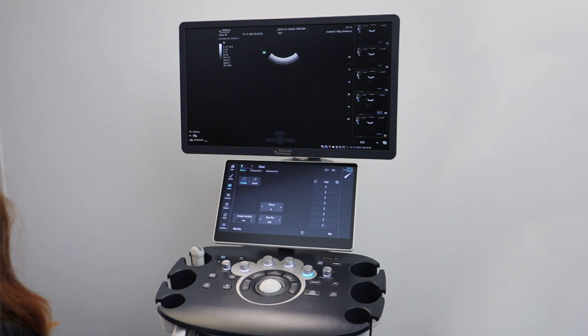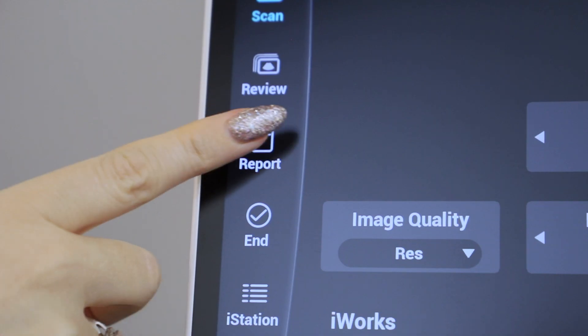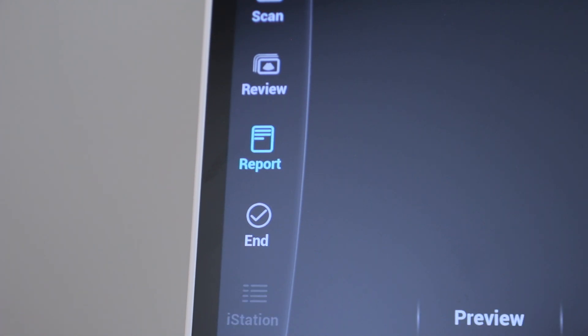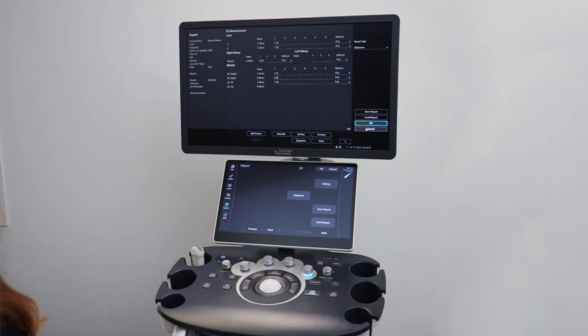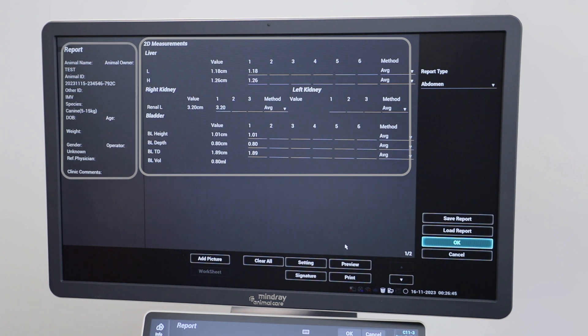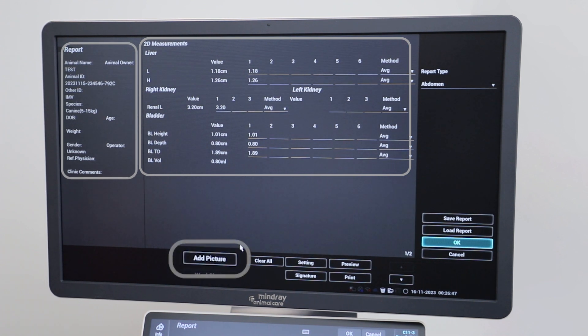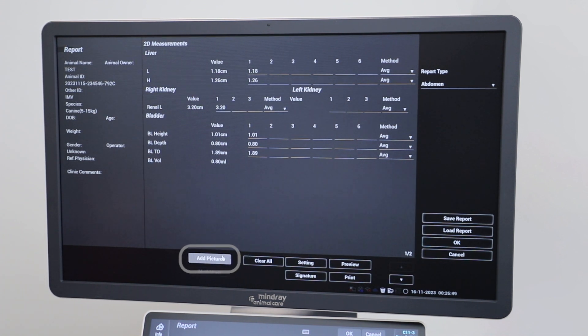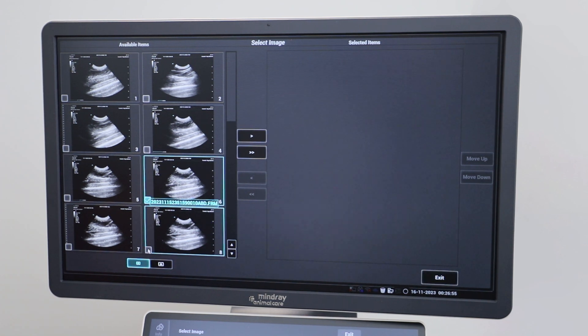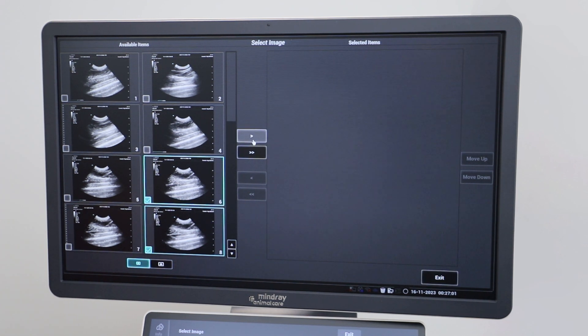To create a report, press report on your small screen where it will bring up any labeled measurements you have done as well as the patient information. From here you can select which images you wish to include in the report and make any additional comments.